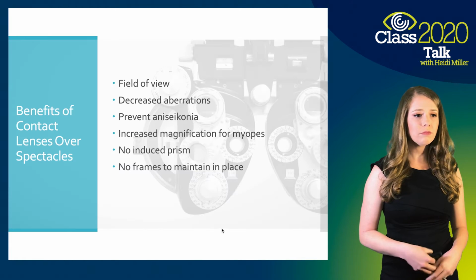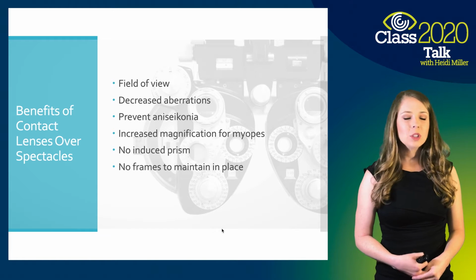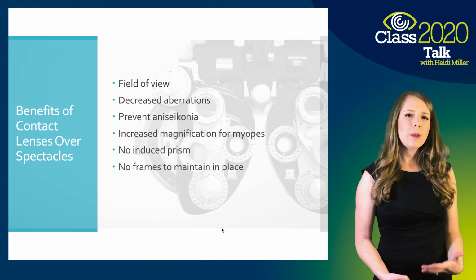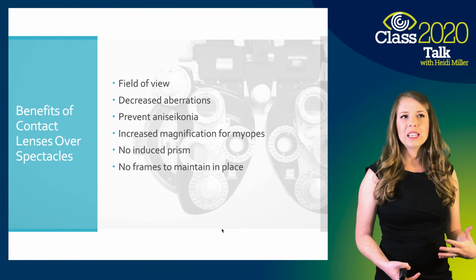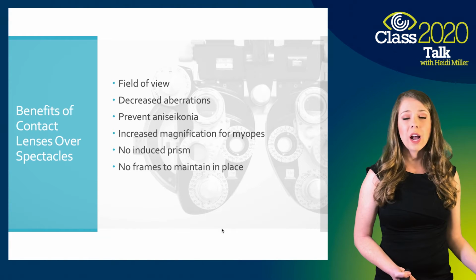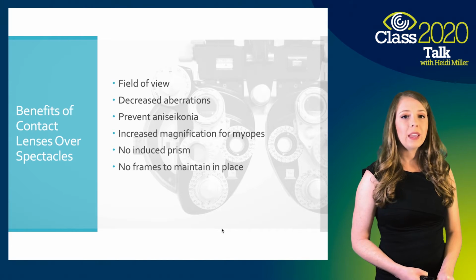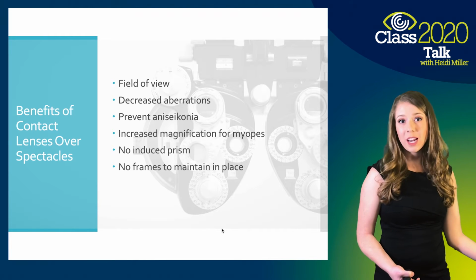Benefits of contact lenses over spectacles. A lot of times, we apply these applications to our adult patients and we tell them all the great reasons why they should wear contact lenses, but we forget about these same applications for pediatrics. And I don't know if it's related to the idea that we think it's going to take more chair time or it's going to be a little bit more difficult because it's a child, but really in studies that have been done, it doesn't take too much more chair time to fit a child versus an adult. And so we should really apply some of these benefits for contact lenses when we're thinking about our pediatric patients.